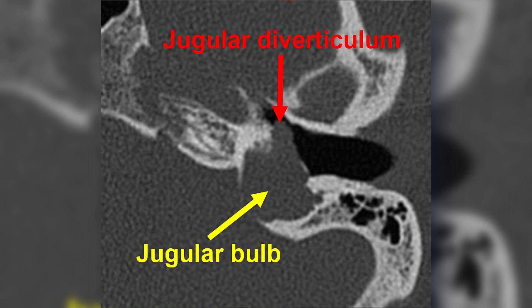Jugular bulb diverticulum is a congenital vascular anomaly characterized by a sac-like or digitiform protrusion originating from the jugular bulb. It is generally an incidental and asymptomatic finding. In symptomatic cases presenting with pulsatile tinnitus, it is usually associated with a dehiscent jugular bulb.